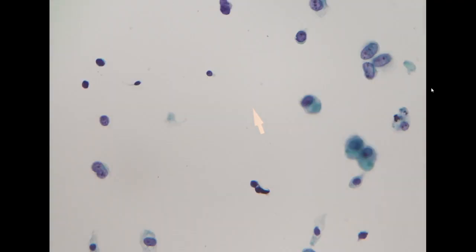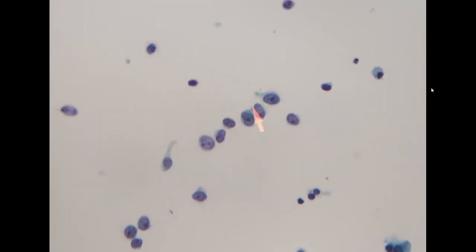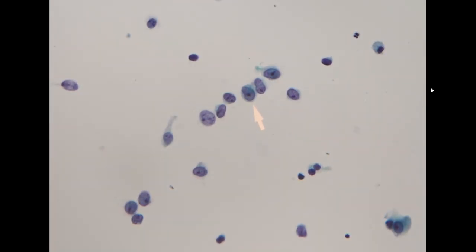The chromatin pattern, however, is more hypochromatic instead of the hyperchromasia chromatin that we were familiar with. In almost 20% of the cases, you will see this hypochromatic chromatin pattern.